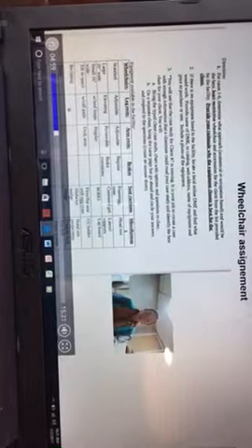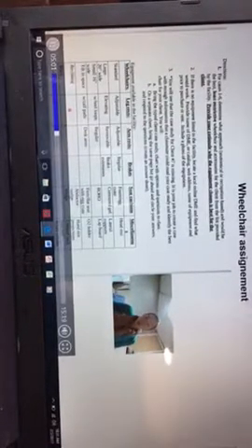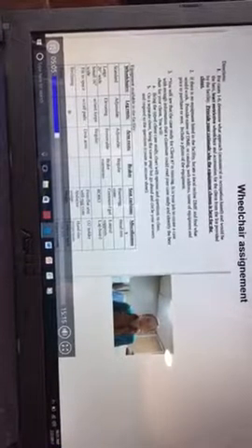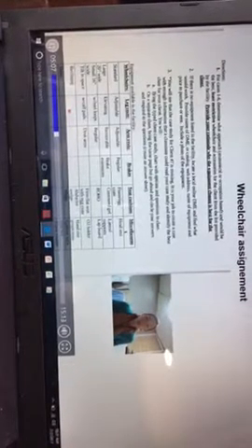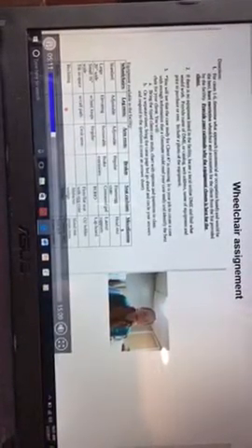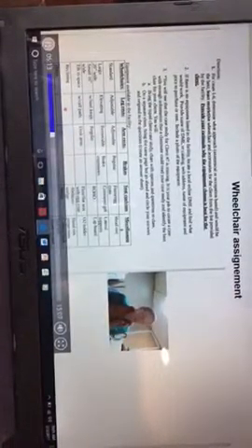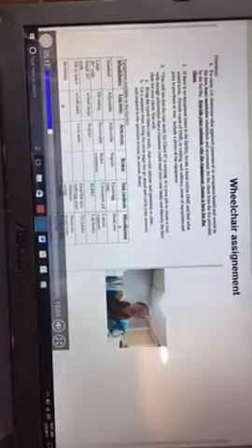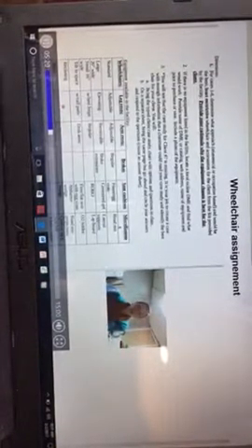The desk arms are more from a functional perspective. They allow me to get closer. If I'm a full-time wheelchair user, the desk arms might be helpful because then I can actually get up to a table and do my eating. I can get up to a table and do my schoolwork. So those are things to think about as you're picking your armrests.